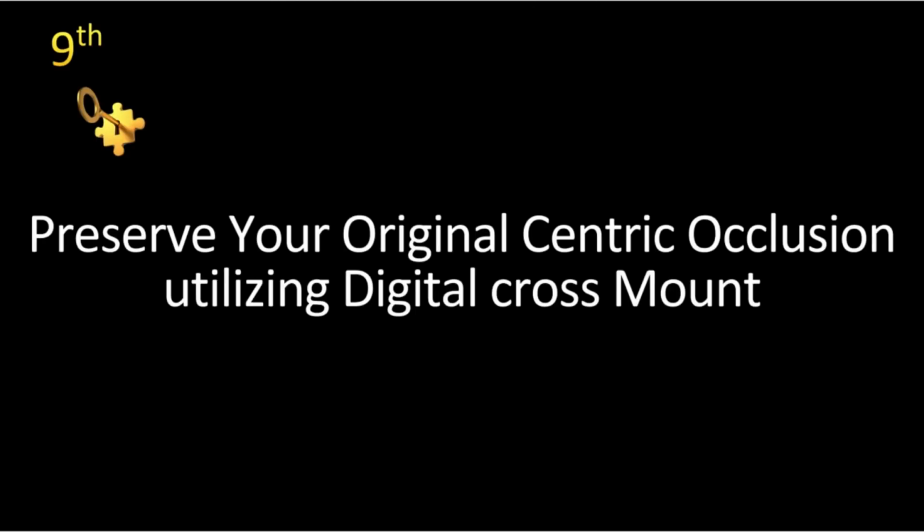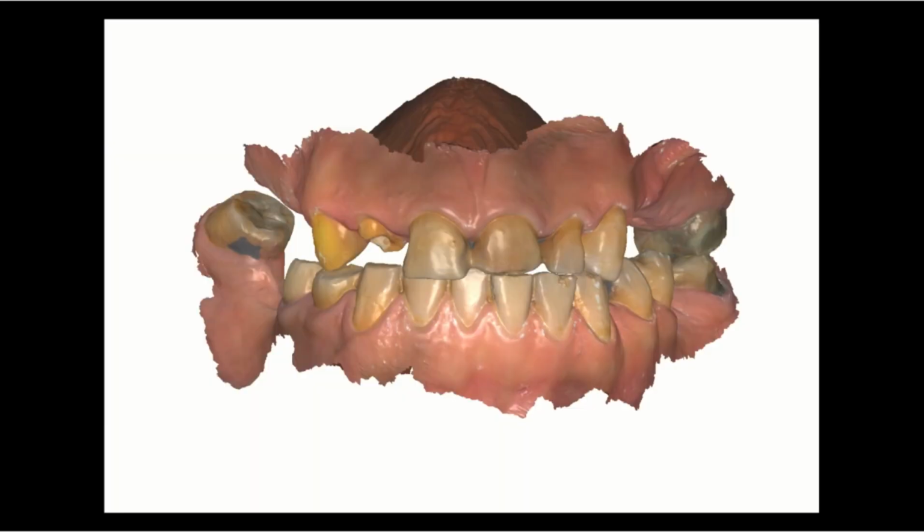This key shows how we can preserve the patient's original bite and transfer it to the final prosthesis. One of the main benefits of the digital era is the preservation of the original bite by a pre-operative scan. Even if you lose the bite due to the preparation of all teeth, as in full mouth rehabilitation cases, there is no problem. You can easily align the original bite scan and make digital cross mounting in a very accurate manner.